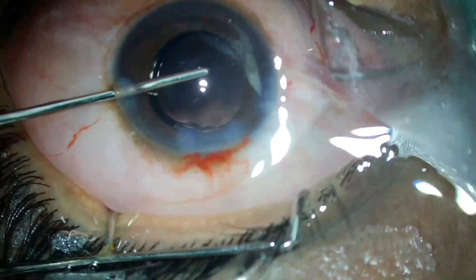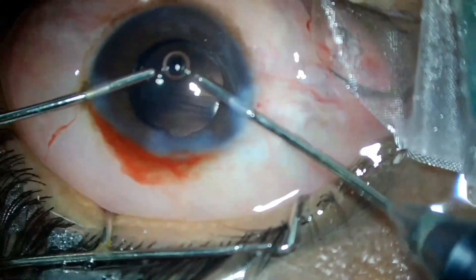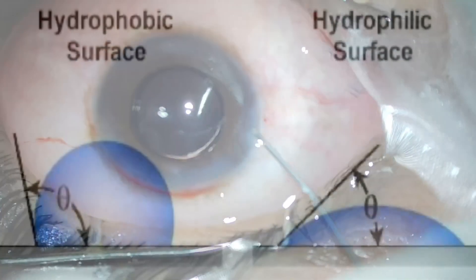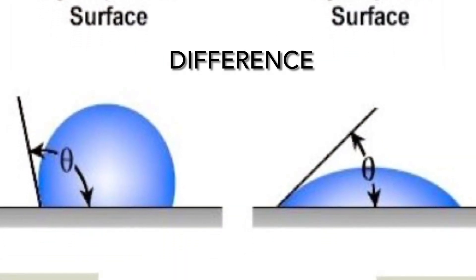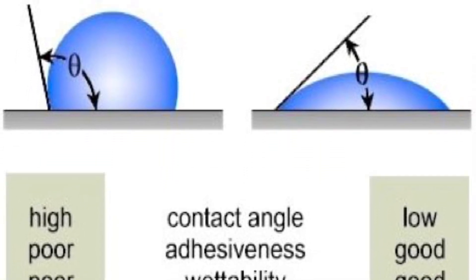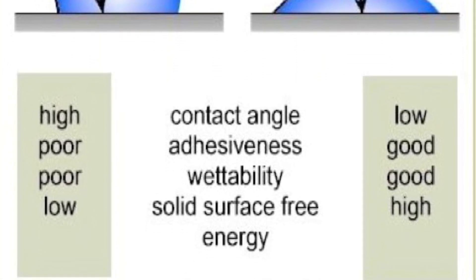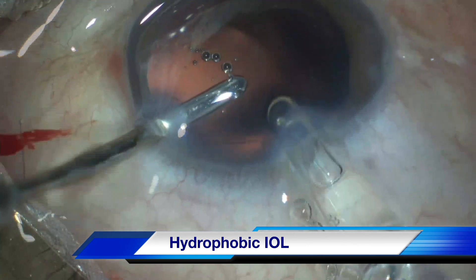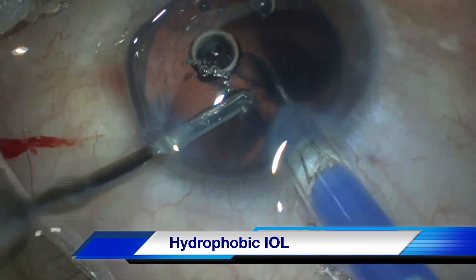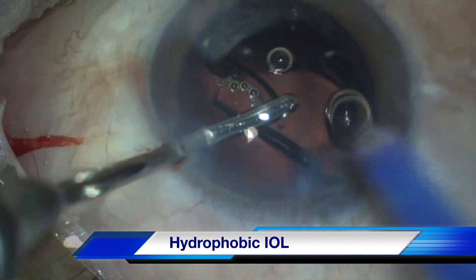As the name suggests, hydrophilic lenses remain drenched with fluids and have lesser recoil memory, making them more pliable in an aqueous environment. So hydro implantation of hydrophilic lenses is easier compared to hydrophobic lenses. Hydrophobic lenses have better optics and higher memory.